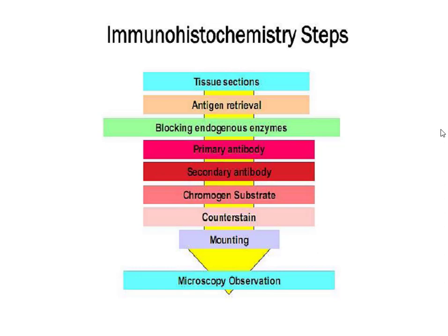Then we use the counterstain and mounting. The slide which is ready for use is given to the pathologist for microscopical investigation.